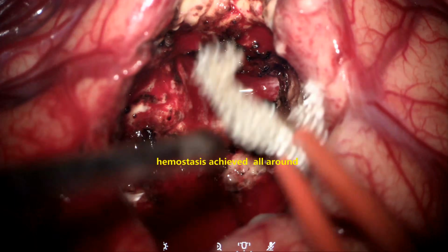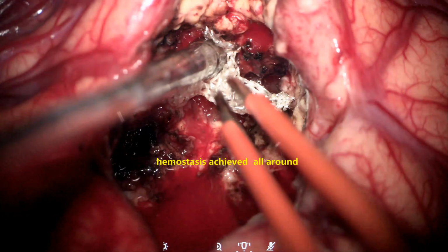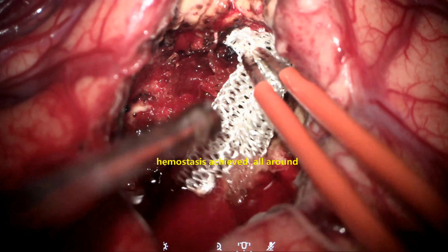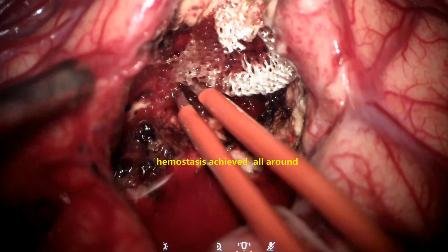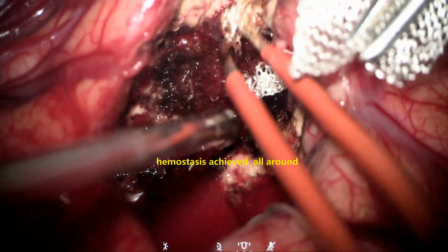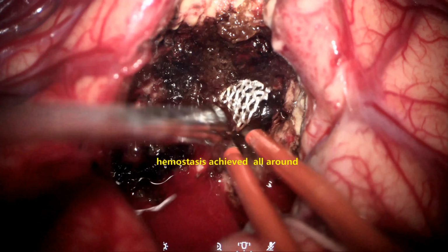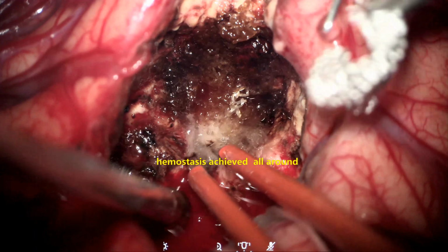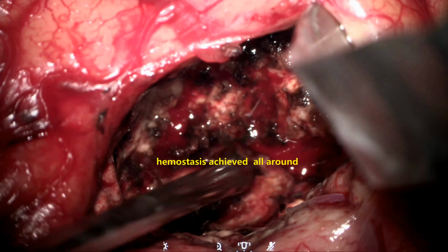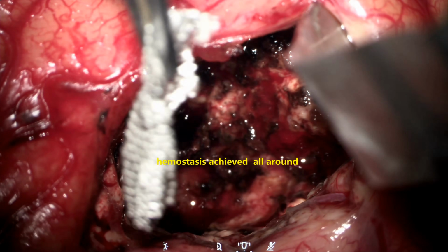Now the deeper part of the tumor is taken out completely, anterior, posterior, medial, lateral, and hemostasis is achieved. Sometimes we need a Surgicel, and coagulating on the Surgicel is of great help. It sticks to the tissue and prevents the slow oozes from the capillaries of the small vessels. This technique we have followed for almost 2 decades, and it is of great help.